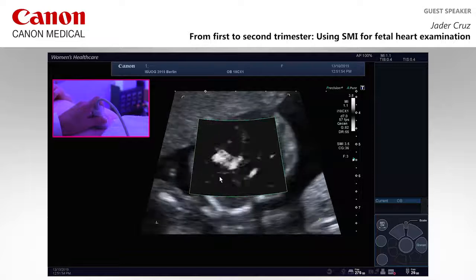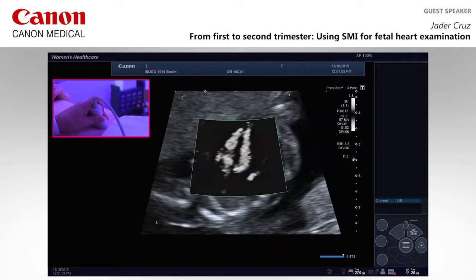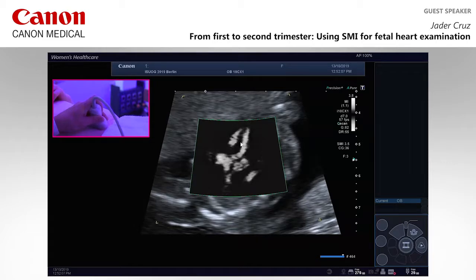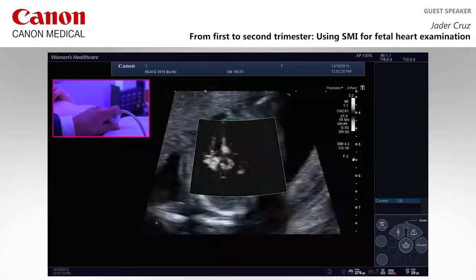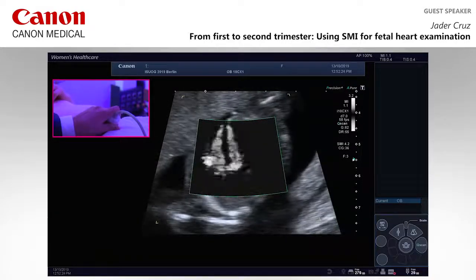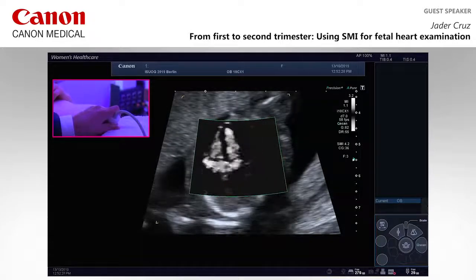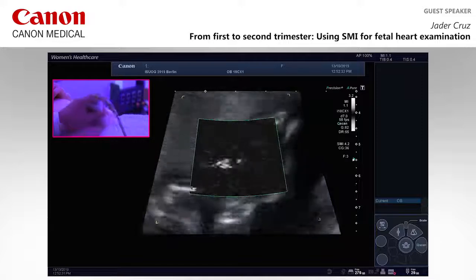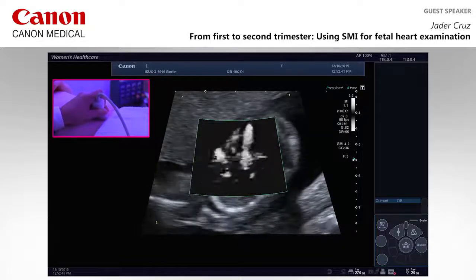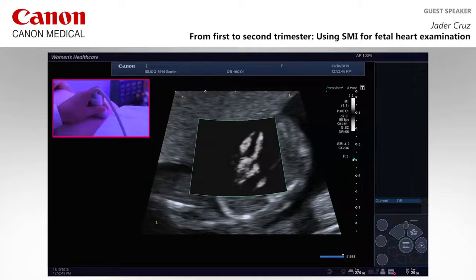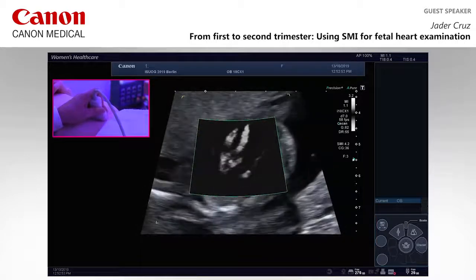We still have some noise, but if you focus on what we're looking at, the CineLoop works very nicely. You can clearly see the interventricular septum, the aorta, and the perimembranous region. We are in an upright position, not at the right angle to the septum, and you can still see the septum very well — you don't really need to be at the right angle to see it. Moving to the outflow tracts, we can clearly see there is no communication in the perimembranous part of the ventricle.